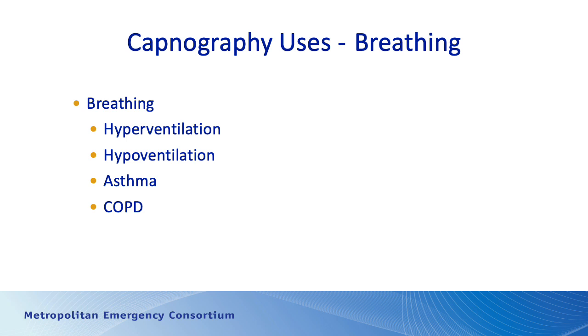So if the patient has COPD and their capnography shows a CO2 of 50, you provide some bronchodilators and maybe some CPAP or BiPAP, and then the CO2 goes down to 38, well, then you can make a pretty safe determination that your treatment and therapy has improved the patient's condition. So that's an example of how we can use capnography to assess response to treatment. And we'll go into more detail about that next month in the second half.